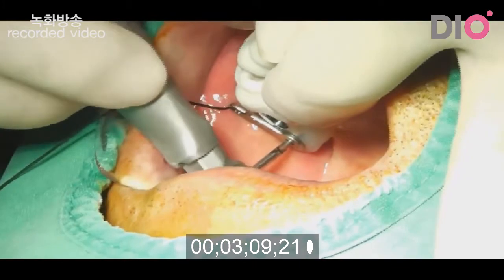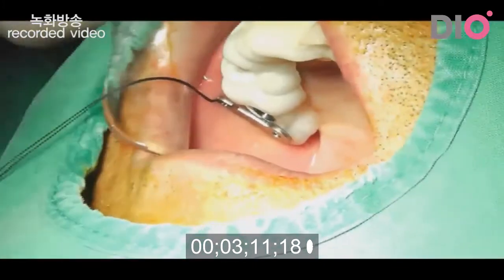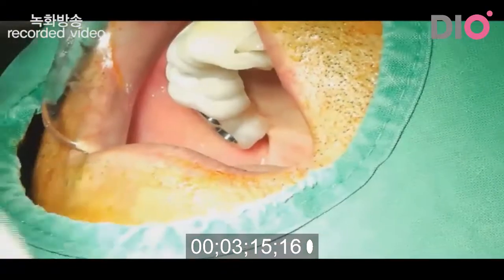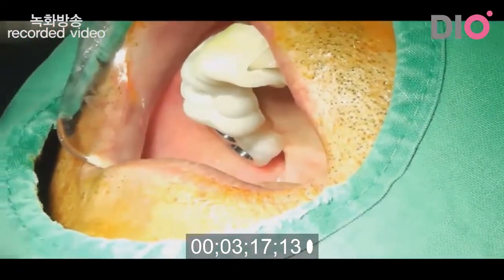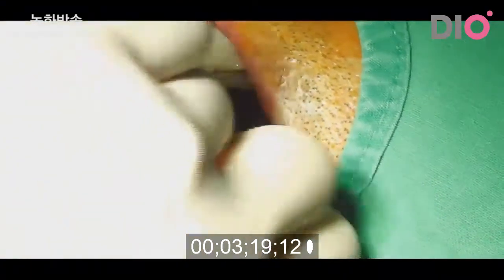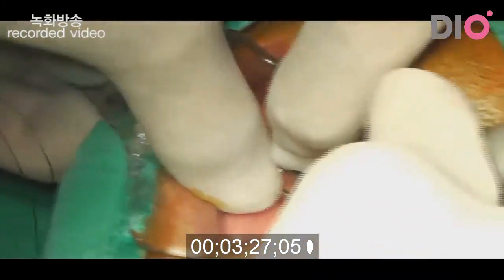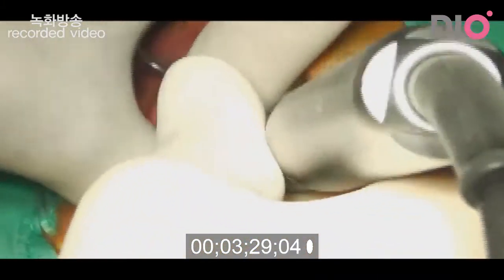Okay, he has a very limited mouth opening. In this case, I inserted the drill into the guide and then reinserted the drill. Okay, and then inserted the drill tube.